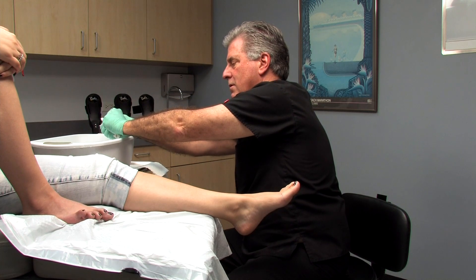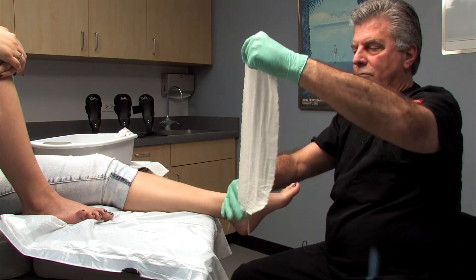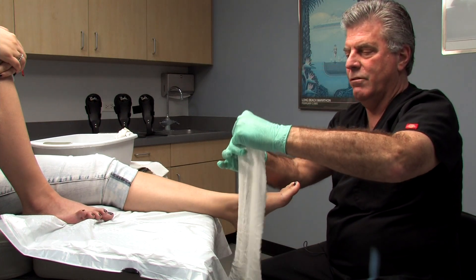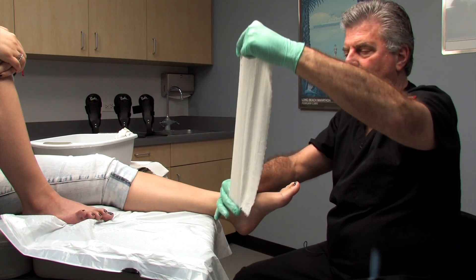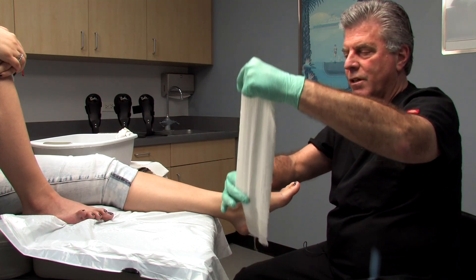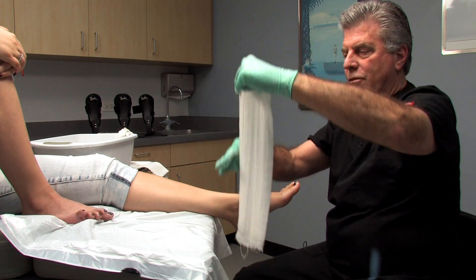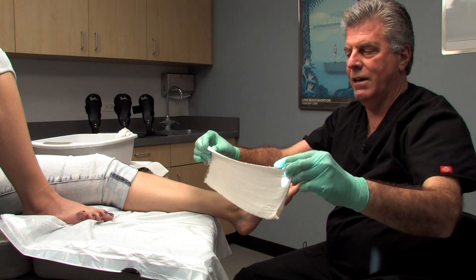With this second strip, we're going to begin to rub out the plaster. The wetter the plaster is, the faster it's going to cure. By getting it good and wet, you work the moisture into all of the particles of plaster to activate the curing process quickly. I like to rub it out ahead of time, though you don't have to do that.